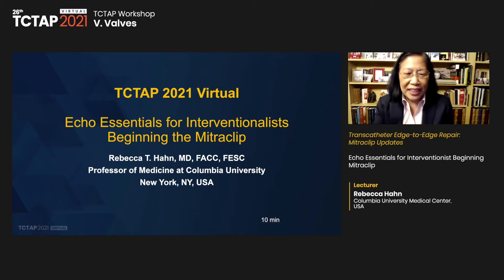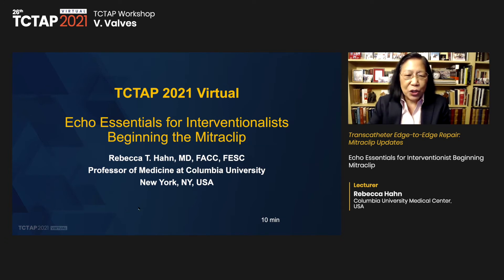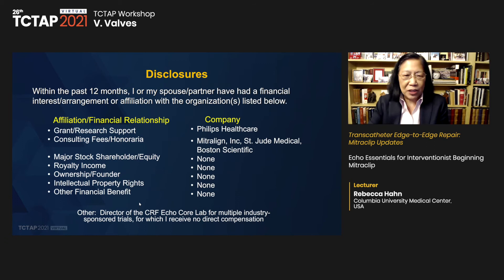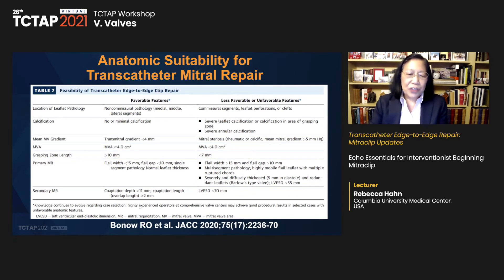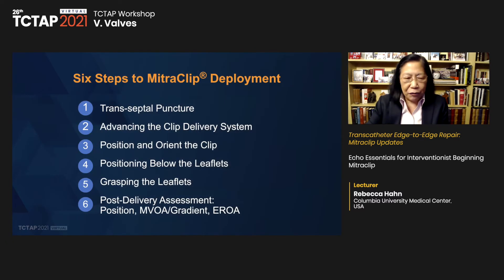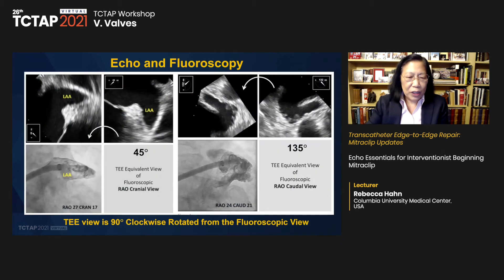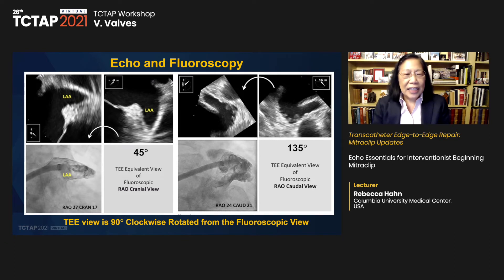After identifying the transeptal puncture — probably the most important part of the procedure, as it determines how easily catheters can be directed to the precise clip location — we advance the clip delivery system. As the clip comes in, we continuously watch its direction to ensure it doesn't touch adjacent structures. For positioning and orientation, we rely heavily on three-dimensional imaging — triplane mode or live 3D multi-planar reconstruction — to see the clip orientation relative to the coaptation line.